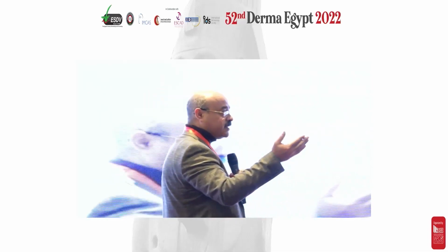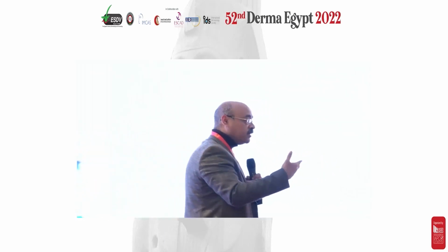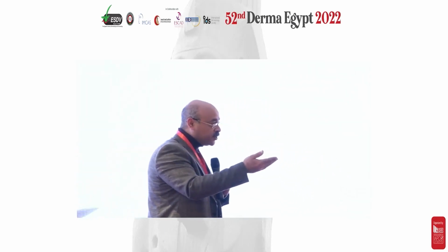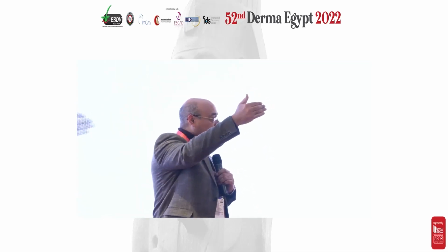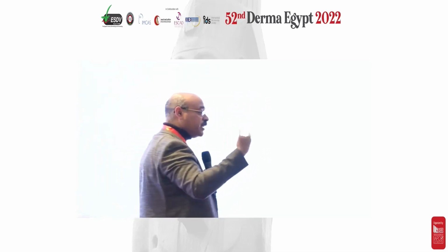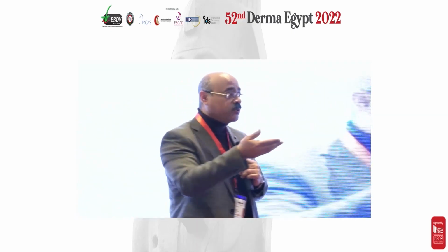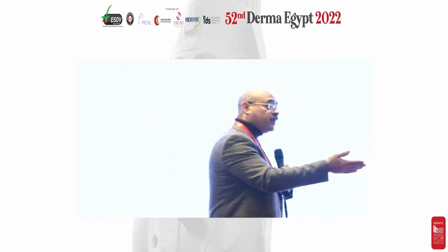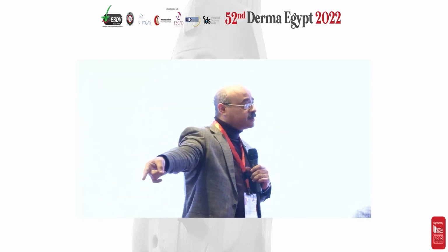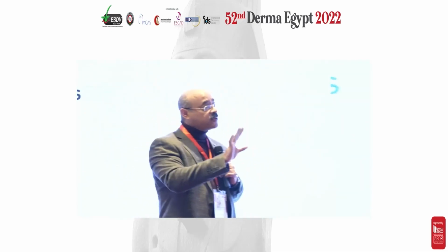For example, for the past 10 years, I'm using the Nd:YAG, non-ablative, in order to stimulate the collagen every 6 months, 2 times per year, plus microdermabrasion, something like that, to improve the epidermis. So we can use those modalities to keep the skin in good shape, and it's not going to be a huge cost because it's 2 or 3 times per year for the patient. And after 10 years, the patient will be looking much younger than when we started. This is the anti-aging program, and it improves the pores significantly with no downtime.